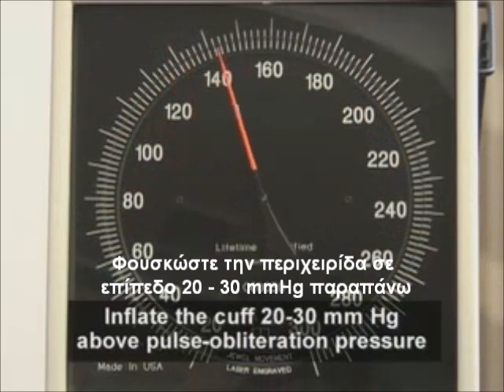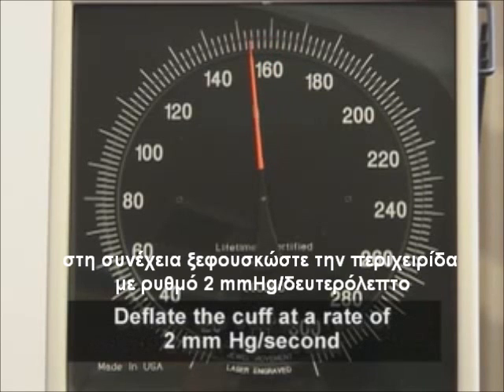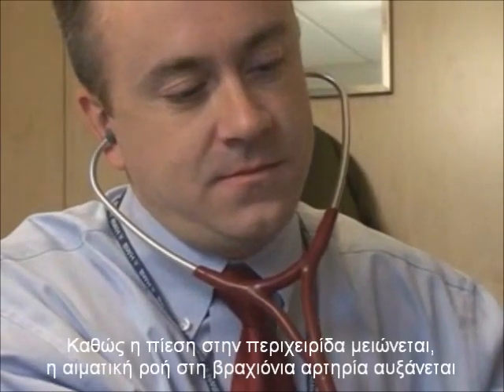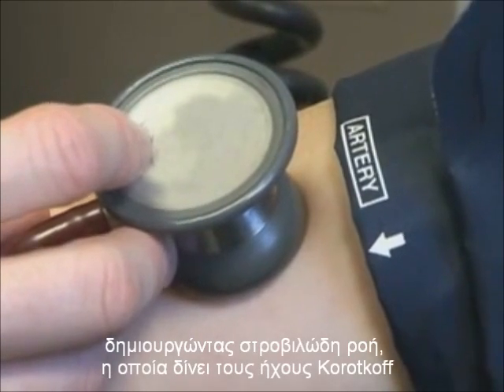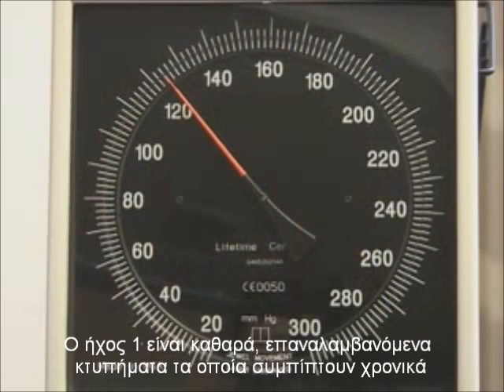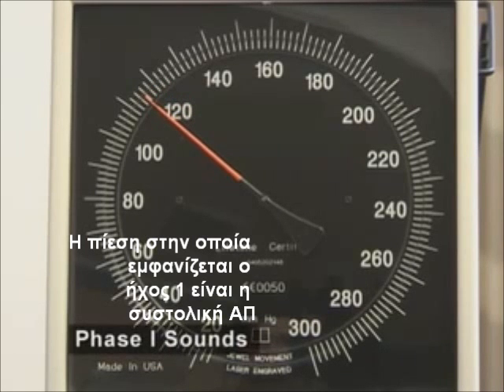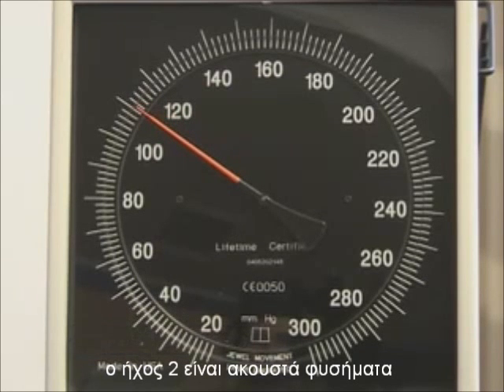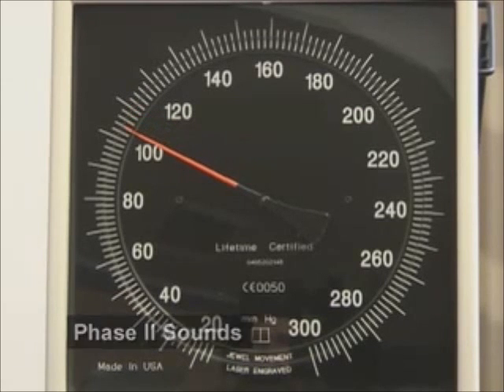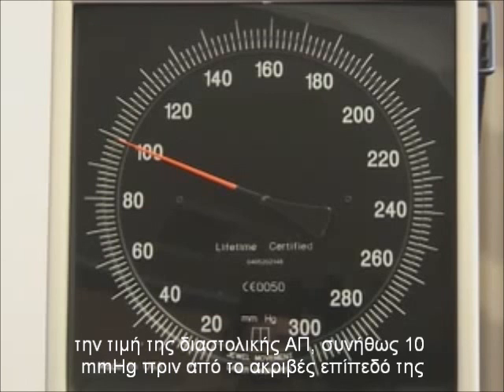Inflate the cuff to a level 20 to 30 millimeters of mercury above the pulse obliteration pressure. Then, deflate the cuff at a rate of approximately 2 millimeters of mercury per second while listening for sounds. As the pressure in the cuff is decreased, blood flow in the brachial artery increases, creating turbulence, which generates Korotkoff sounds. Phase 1 sounds are clear, repetitive tapping sounds that coincide with reappearance of a palpable radial or brachial pulse. The onset of Phase 1 sounds is equivalent to the systolic blood pressure. Phase 2 sounds are audible murmurs in the tapping sounds. Phase 3 and 4 sounds are muted changes in the tapping sounds that occur as the pressure measurement approaches the diastolic pressure, usually within 10 millimeters of mercury of true diastolic pressure.